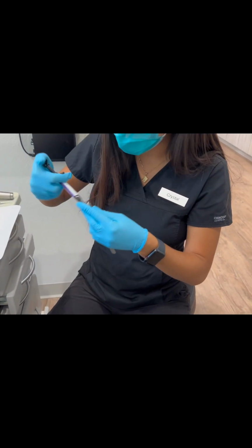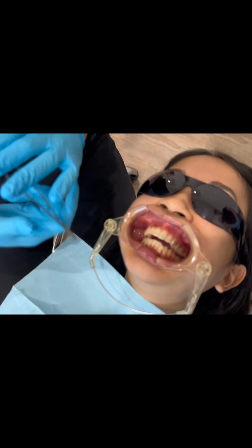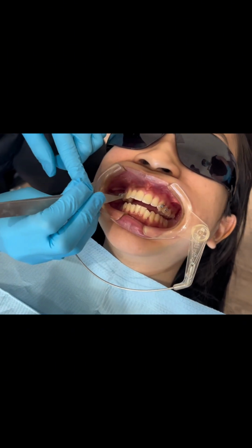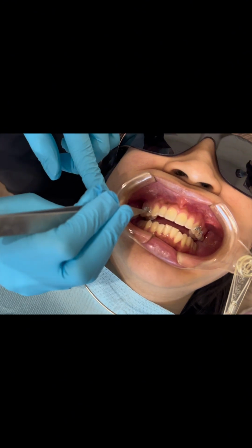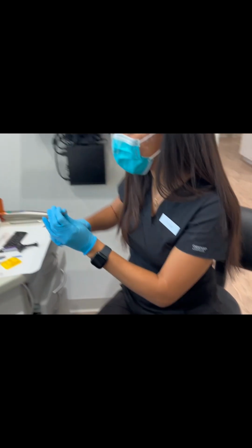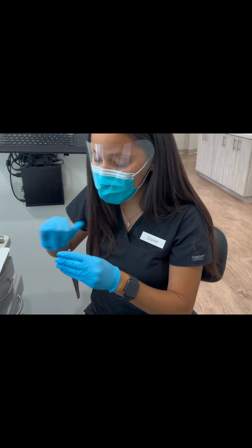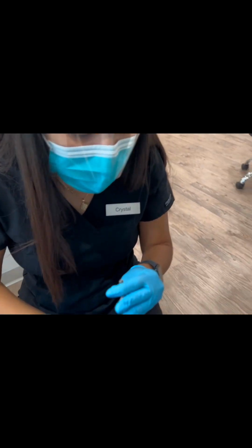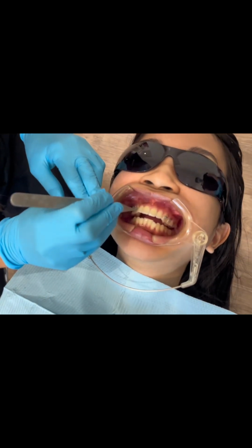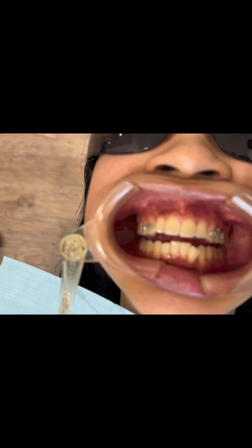Now the reason that you do the back ones is because right now that light is drying our bracket as we speak. It's something that you do gotta be speedy in, okay? It's not gonna dry right away, but it will dry if you're taking an excessive amount of time. You can also cover, and you'll see how I cover it when I'm actually removing the excess glue off of the bracket.